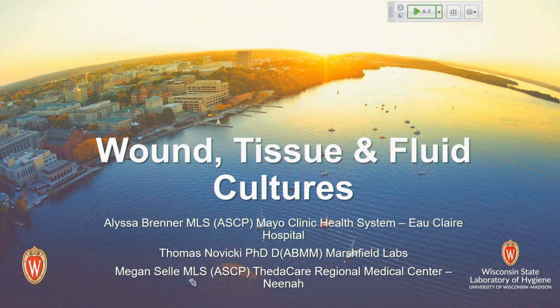Is it in your lab? It seems like every time we do get a series of those, we get the same amount of orders for the AFB and fungal cultures. And we're having a hard time backing up, do we really need that? Are we wasting money, resources, et cetera, for the other specialty cultures?